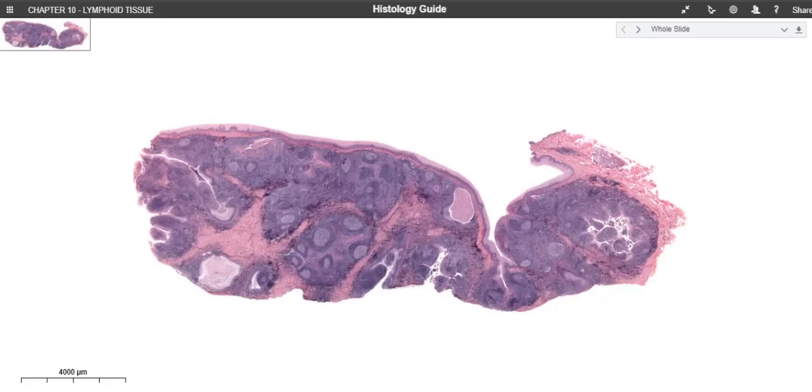is where the lymphocytes are stored, waiting for activation. Okay, so it is a secondary lymphoid tissue. It is part of the mucosal associated lymphatic tissue, what is known as MALT. It is also a diffuse lymphoid tissue.